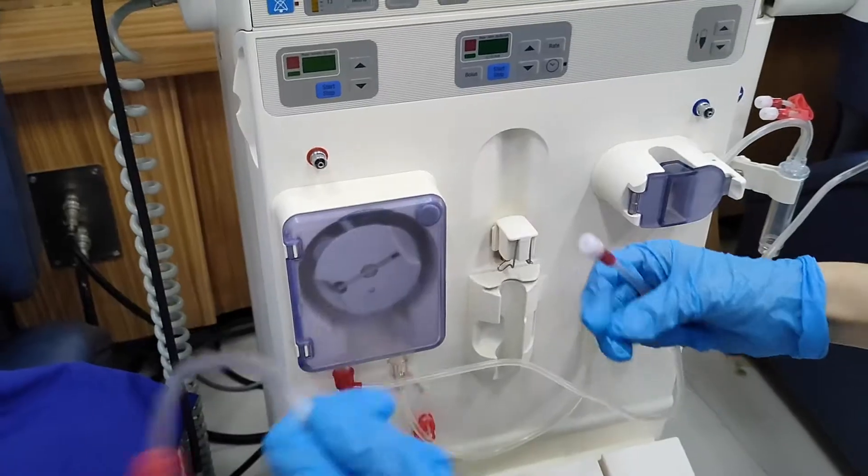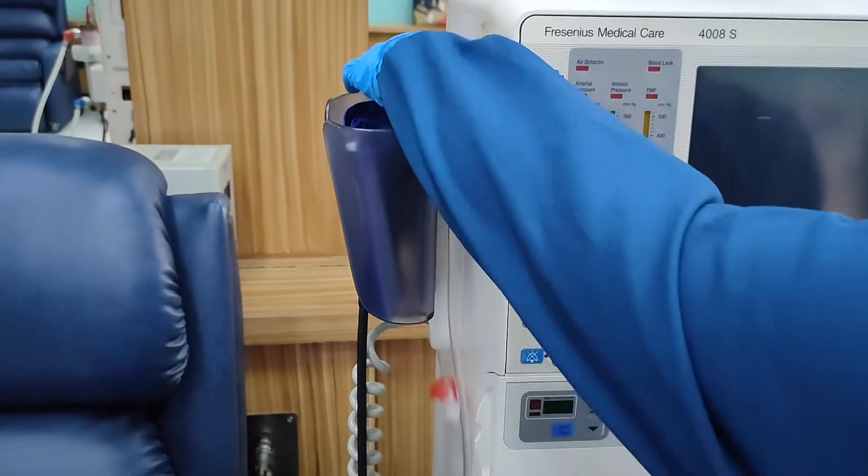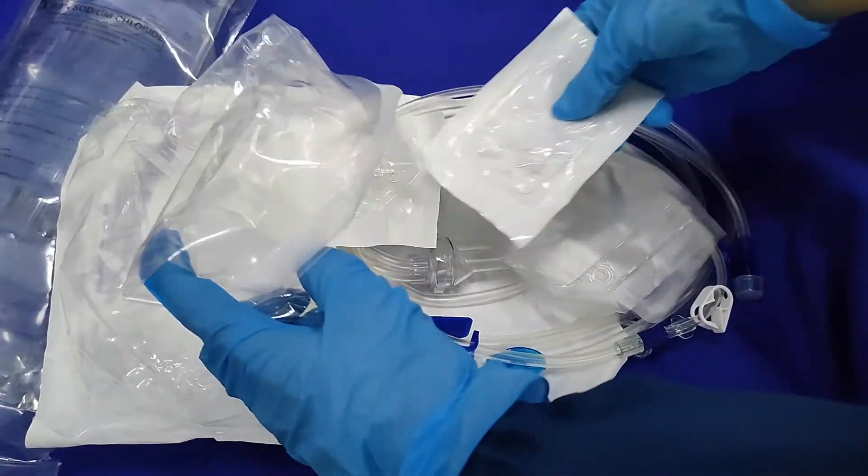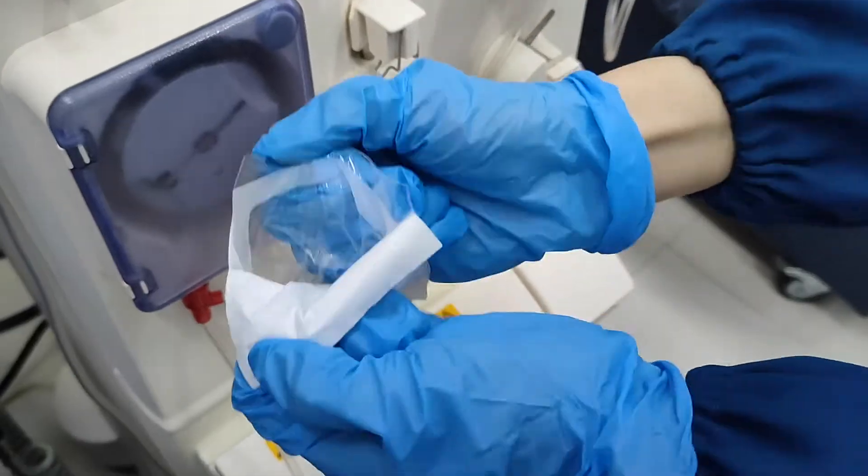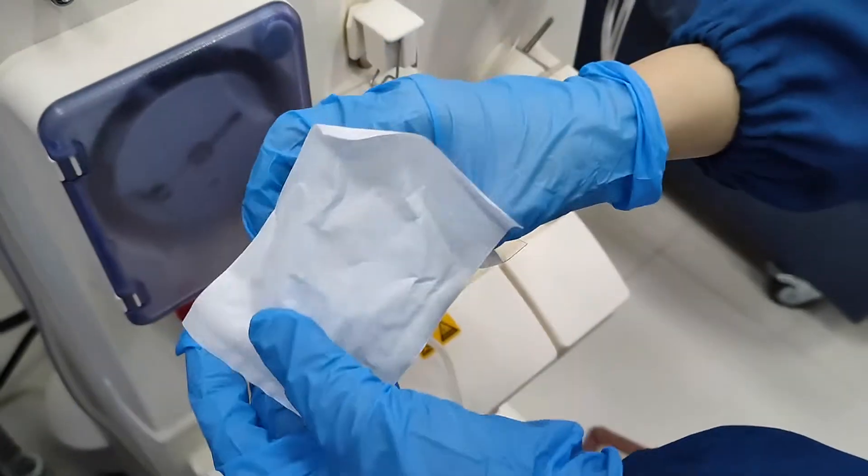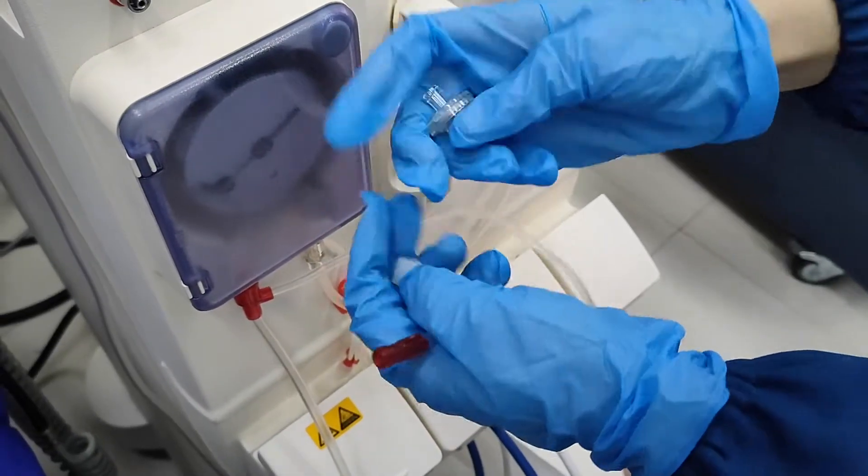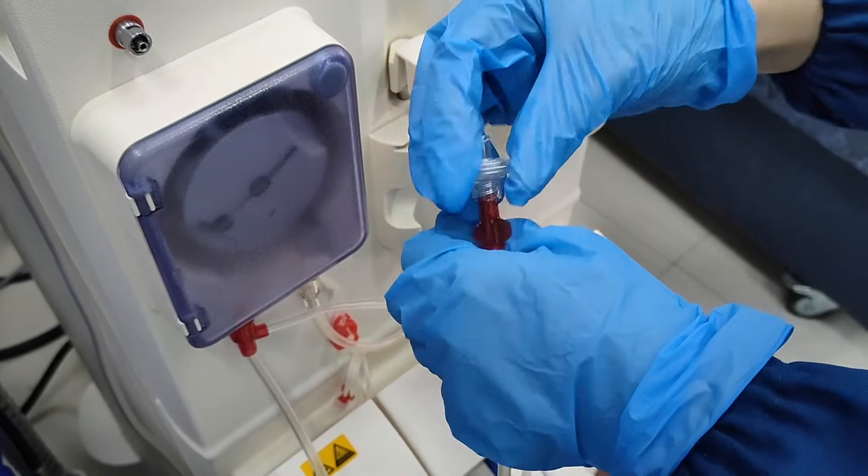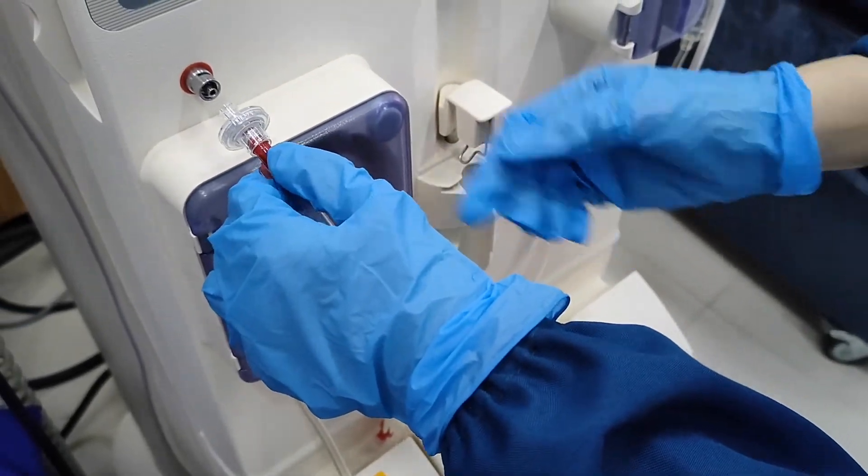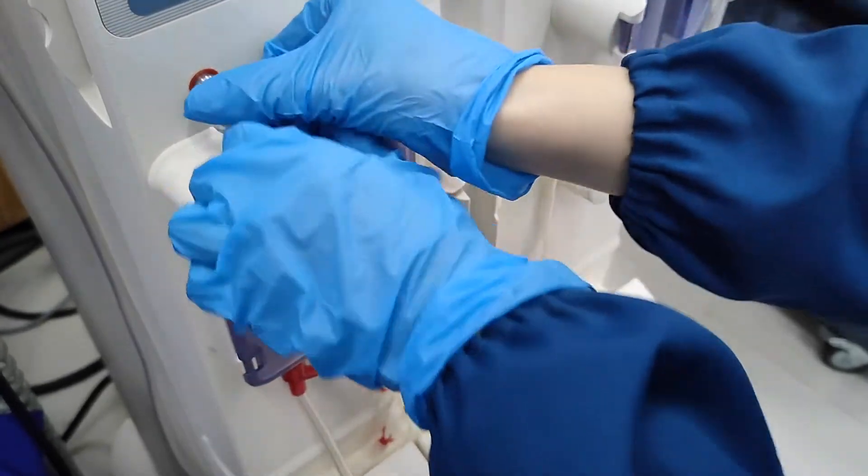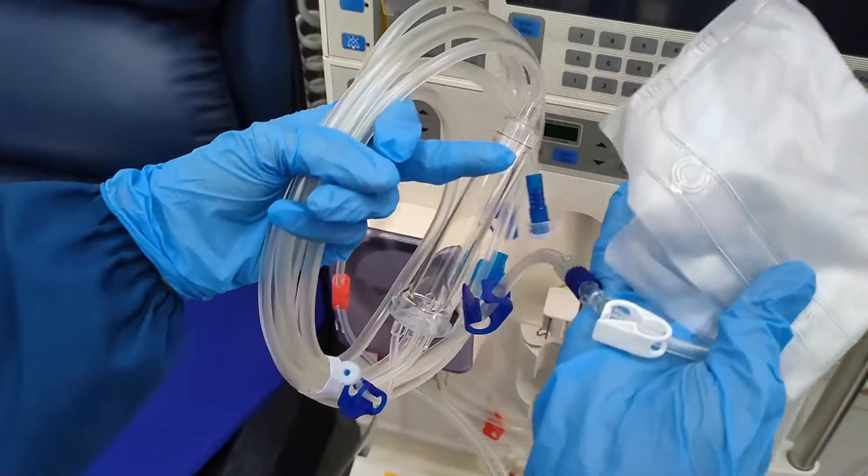Then, temporarily set aside the arterial end. Next, get the transducer and attach it to the arterial transducer port. Then, connect it to the arterial pressure sensor and make sure that it is secured well.